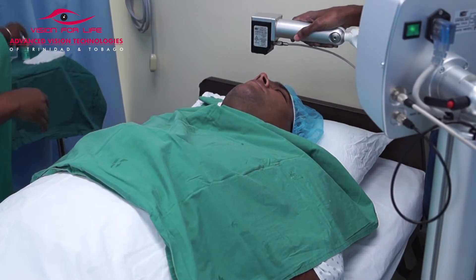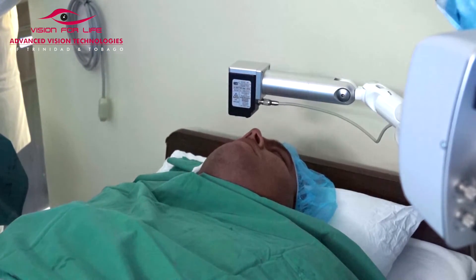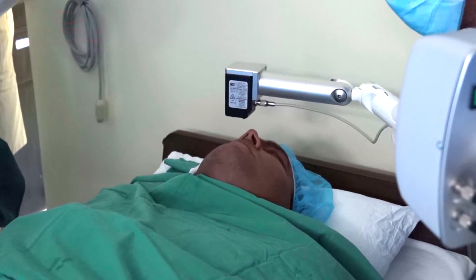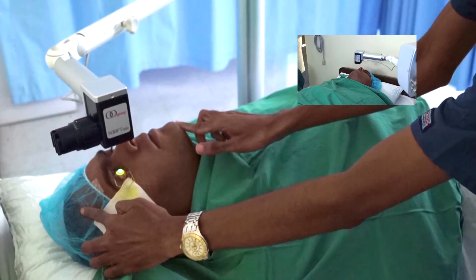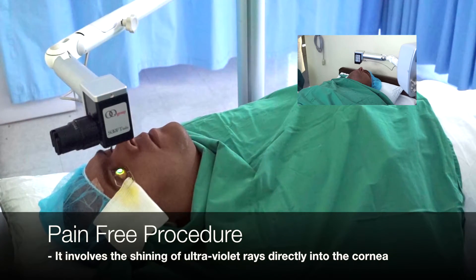After that is finished, a UV lamp which emits high ultraviolet rays is placed onto the surface of the eye, which will cause the riboflavin B2 to be activated within the cornea. That activation leads to the strengthening, or cross-linking, of the corneal lamellae.